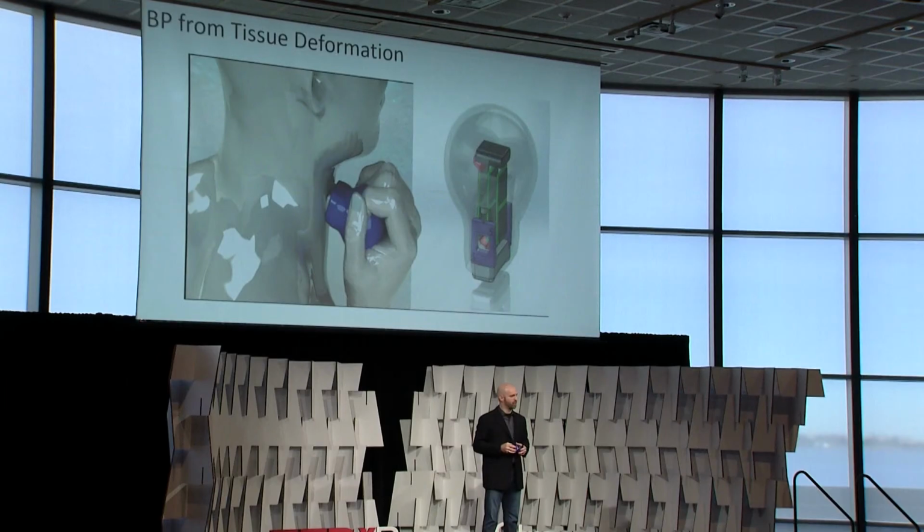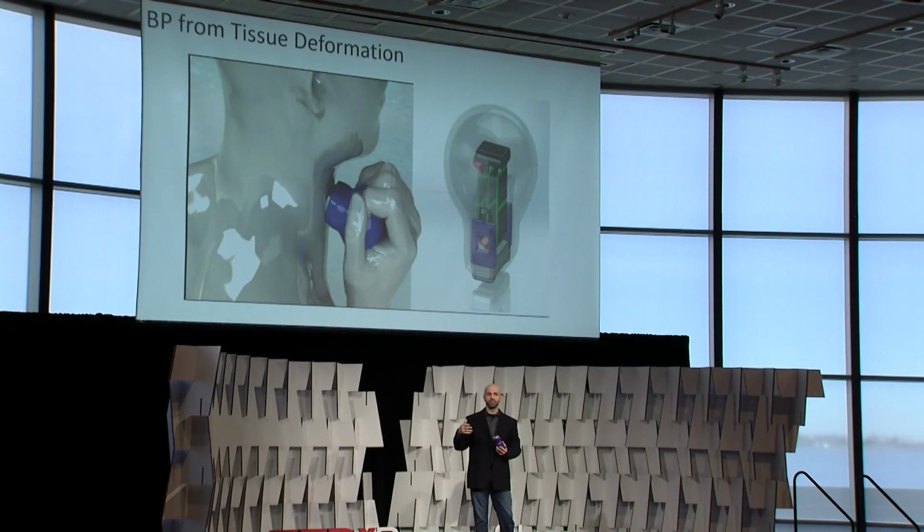So ultimately, we want to try to enable at the bedside, at the vanity while you're shaving or applying makeup, instead of just shaving, pick up this device, touch it, get a measure of blood pressure. And that gives you far more frequent measurements. So we don't really understand in the context of daily living how our blood pressure varies. If you want to get your blood pressure now, you typically have to get the cuff out. So this would give us a way to far more frequently get our underlying physiological data, and that could teach us a lot about the physiology, about our normal variation.